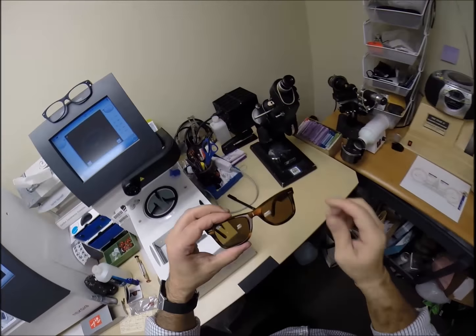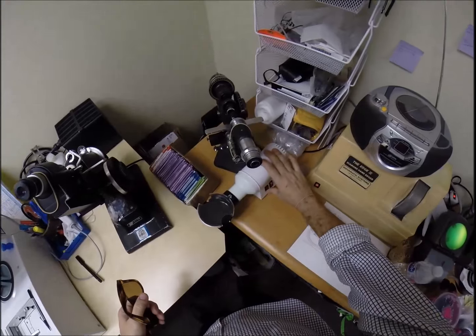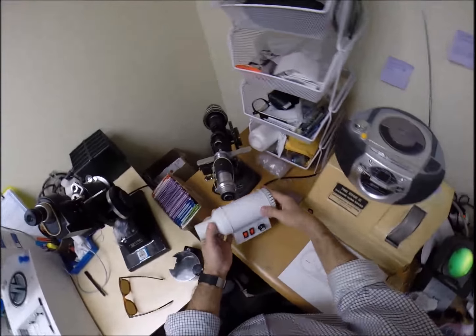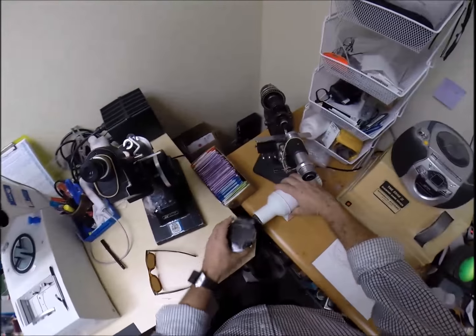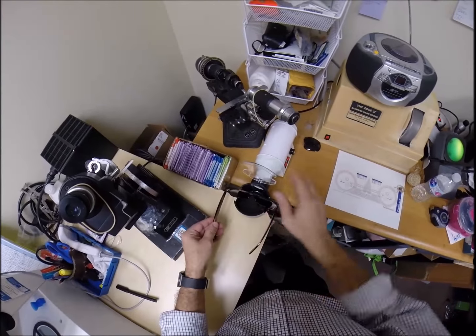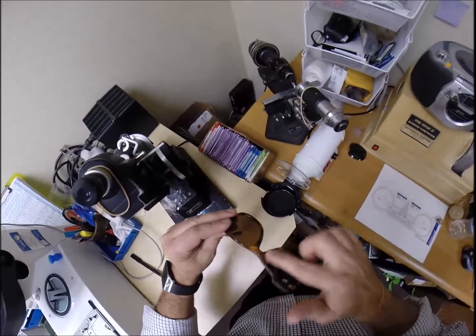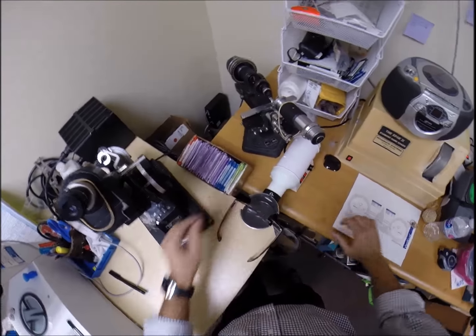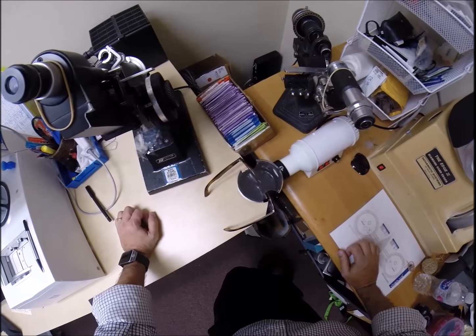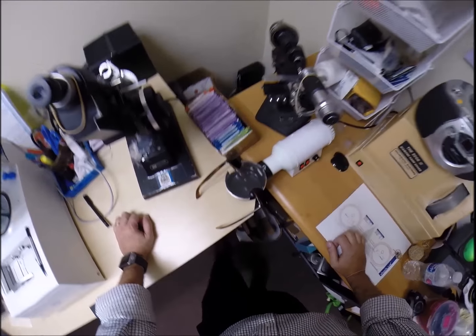If I'm strong enough, I'm going to pop out your original glass lenses, which I doubt I am. So I'm going to put some heat on there. This essentially is a $200 hair dryer, just because they don't make enough of them or enough sales. That's why it's a specialty tool. But I put this in there. Go ahead and close that down. What I'm doing is heating up the bridge area around your lenses to make the plastic a little bit pliable, so the lenses come out easily, and there is no easily with this frame. The only thing harder is getting the original lenses back in there.